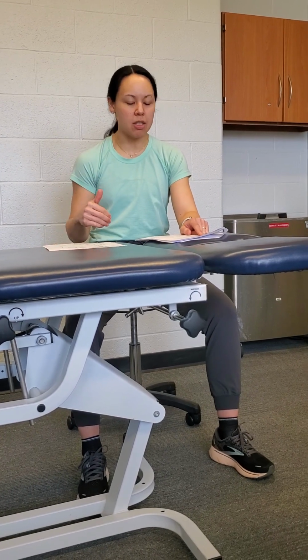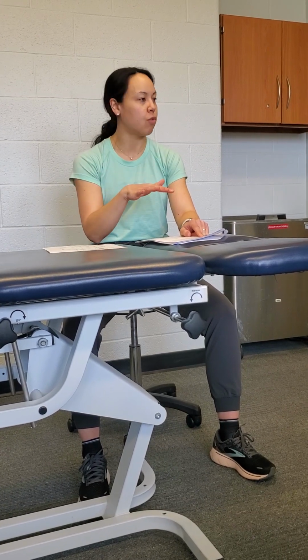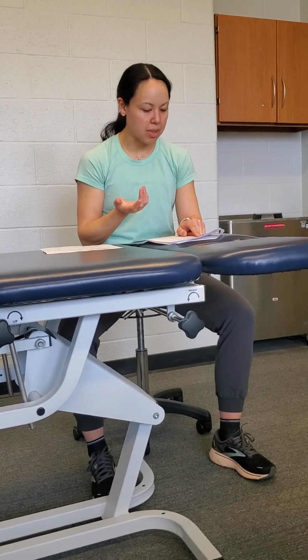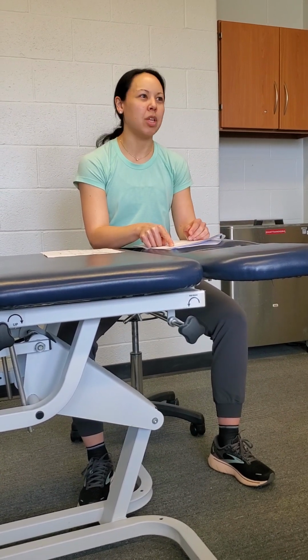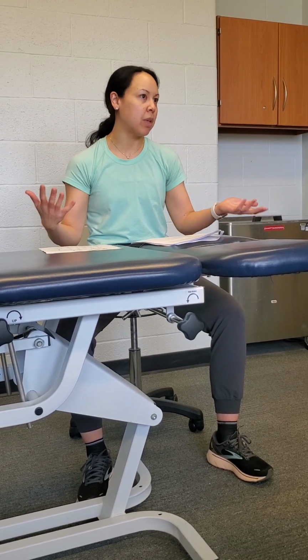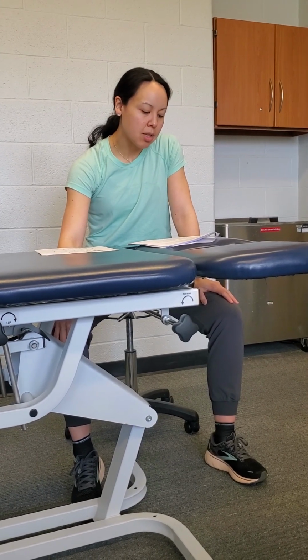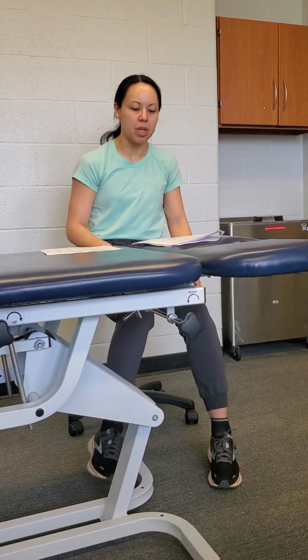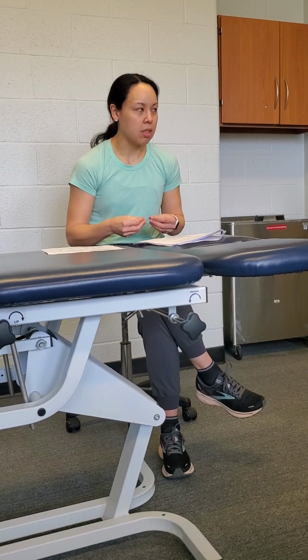During that 30 seconds of rest, the cuff stays inflated the whole time. It's not until they're completely done those 4 sets that you want to deflate the cuff. So 30 seconds of rest between sets and at least 1 minute of rest or longer between exercises, which is pretty typical. You're going to have to deflate the cuff anyways between exercises, and that's plenty of time. Do not deflate the cuff between sets of the same exercise. I already said that. Do deflate the cuff between different exercises, or if you're working different muscle groups. Set 1 is always going to feel easier because the muscle still has oxygen in it.